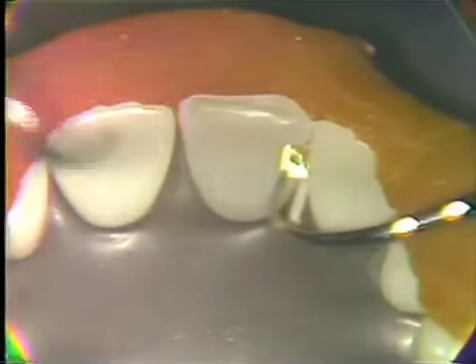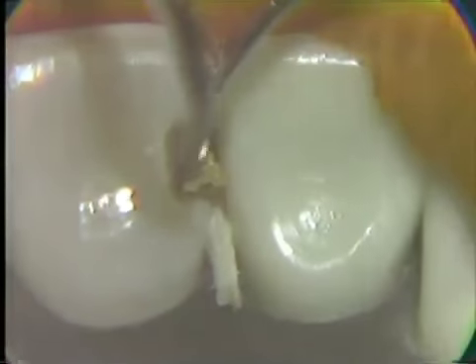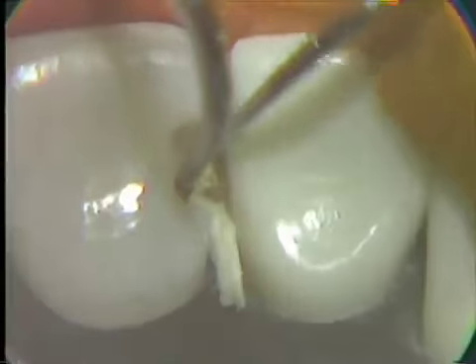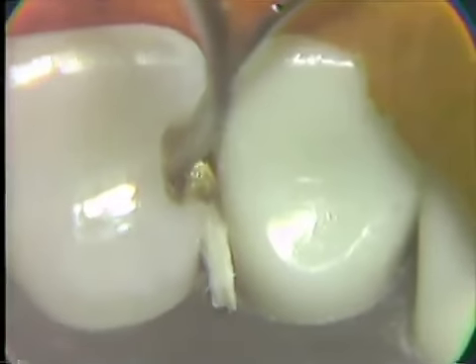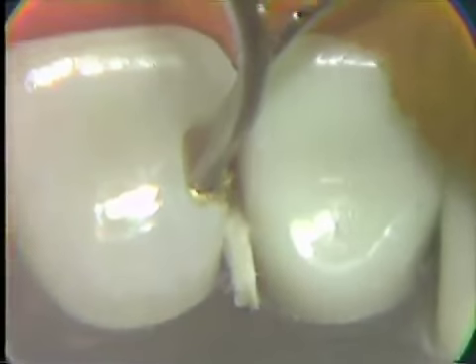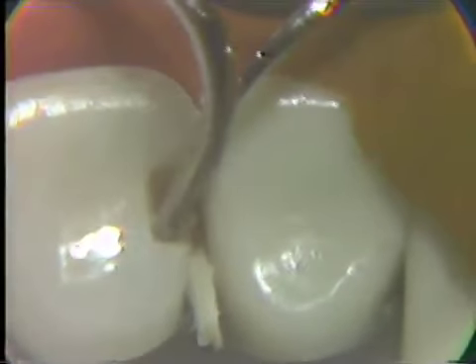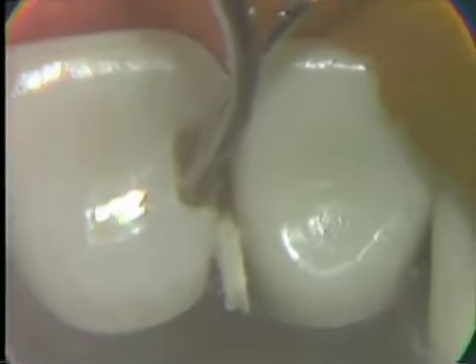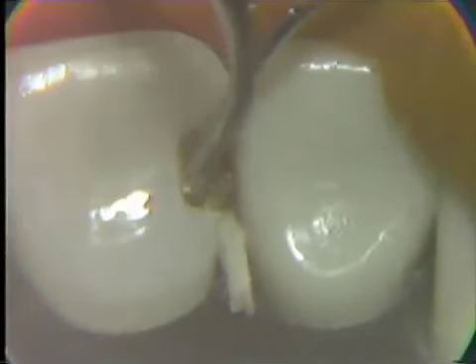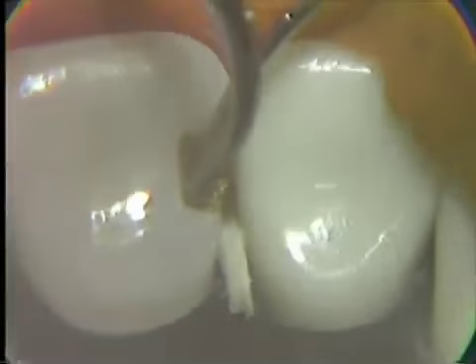Going to start first just laying the piece across that labial to the labial cervical area and begin condensation then into the major retentive area, which is at this lingual cervical. So the holding instrument into the labial, the condensation being initiated into the lingual cervical area.